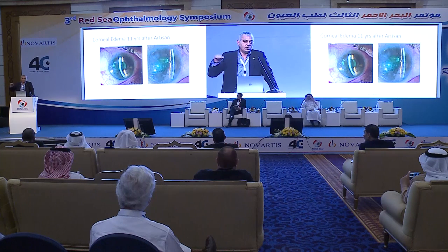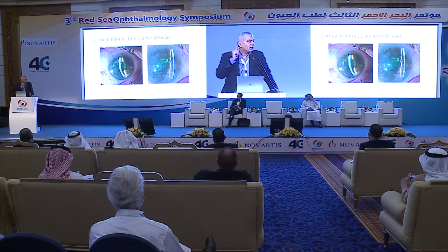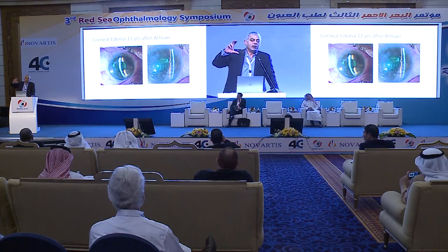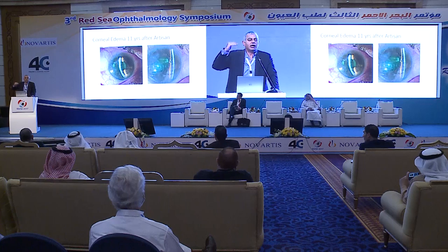We have no long-term endothelial loss. But in many patients with anterior chamber depth less than 2.8 from the endothelium, after 15 or 20 years, the endothelium decompensates. Today, when I see any of my patients who had an Artisan lens with 3 millimeter from the epithelium with a 500 thickness cornea, then it's 2.5 from the endothelium. Even if his endothelium is doing well, I remove the lens today.